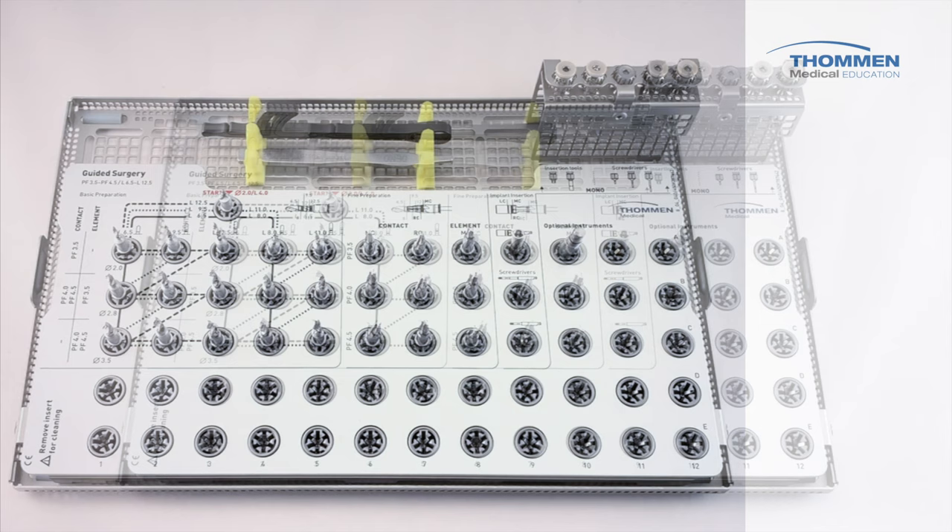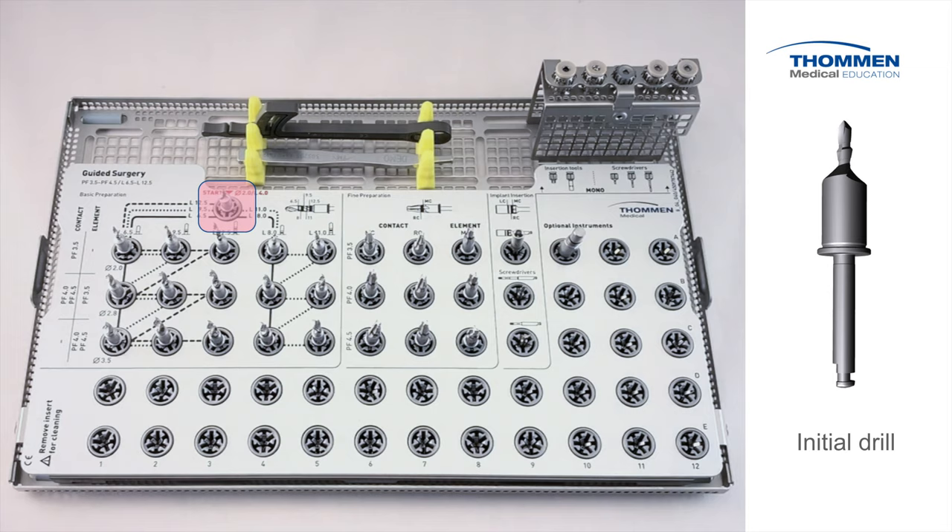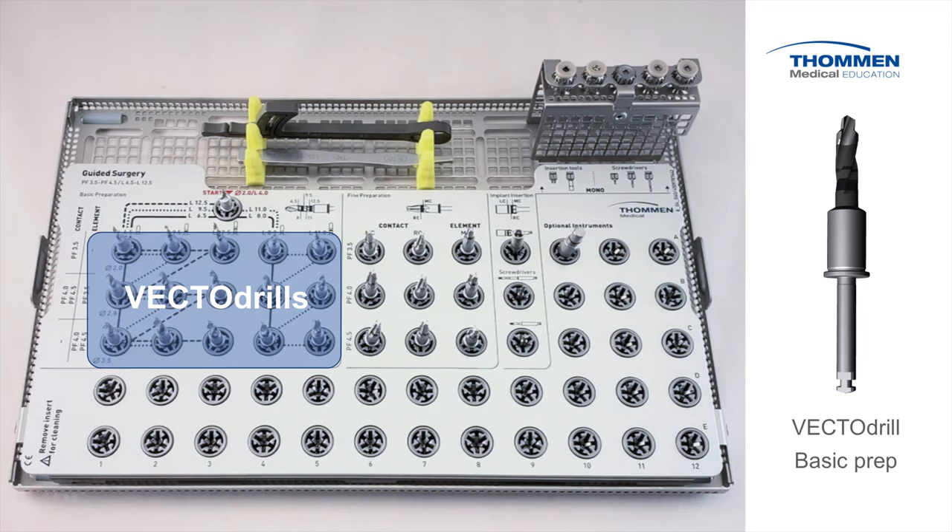Let's take a closer look at the individual instruments and the features and benefits of each. The initial drill is used to start every procedure. It creates the dual point guidance and clears any bone interferences that may hinder the passive guidance system. Basic preparation is performed by VectorDrills — they create the final width and length of the osteotomy. To ensure dual guidance properties, always start with the initial drill and use every drill in the sequence.